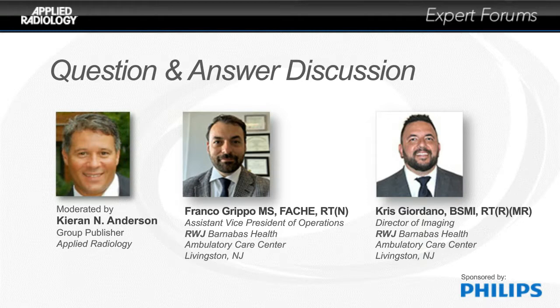I guess a question for both of you. Would you consider a 3T as your only magnet at this stage, knowing what you now know? I think if I had to answer that question 5 years ago, I would say no, due to implant limitations, due to homogeneity restrictions and challenges. With this current system, I would most definitely have a 3T as a primary solitary system in a practice, knowing all that it's able to do and only so very few implant restrictions like a vagus nerve stimulator or something along those lines.